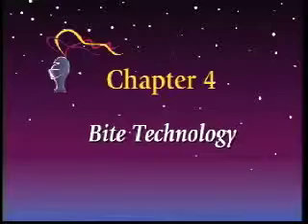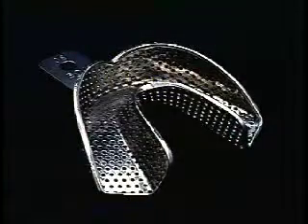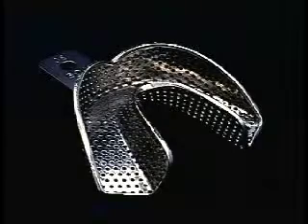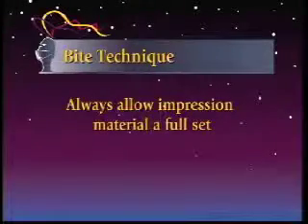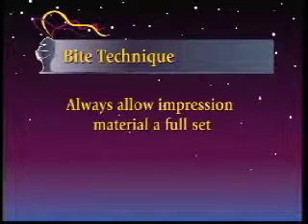The silencer may be fabricated on working models taken from alginate impressions. However, it is very important to use a rigid tray. Never use a disposable plastic tray because there is insufficient support for the impression material. Always allow the impression material a full set before removing it from the patient's mouth.